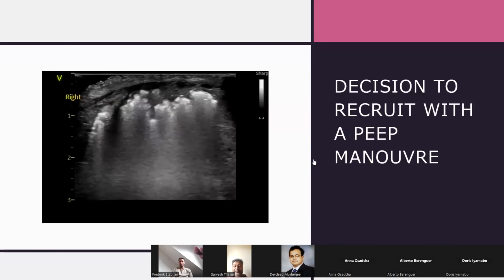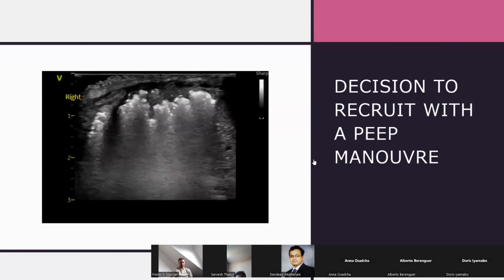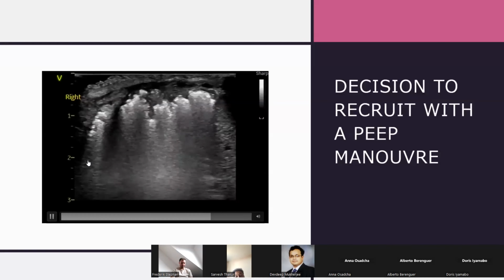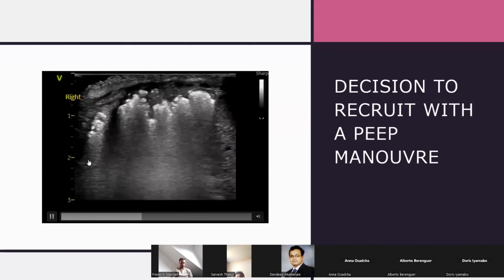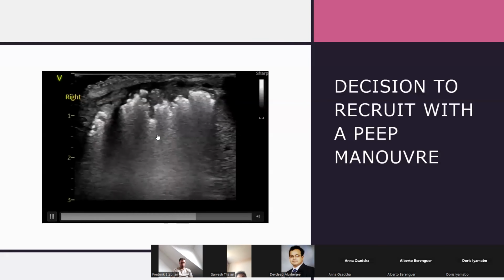So this baby's saturations improved. We were able to get this baby down to 60%. And really, once this baby was more stable, we went in for prone ventilation. We moved the baby prone, and really, this baby was much, much better by the morning, having been prone.